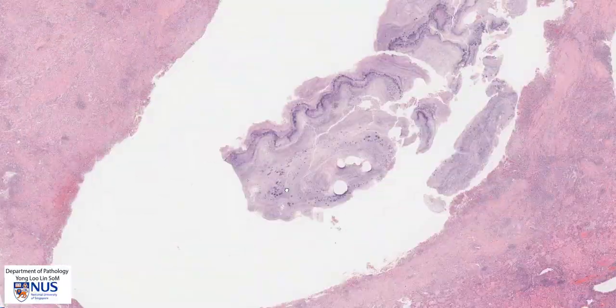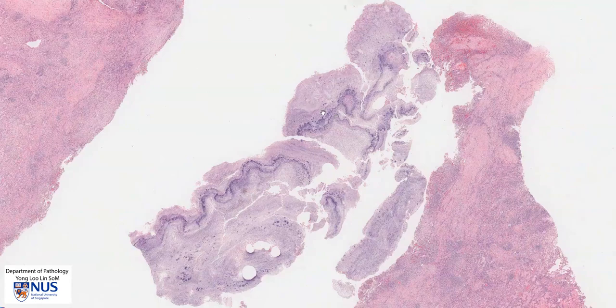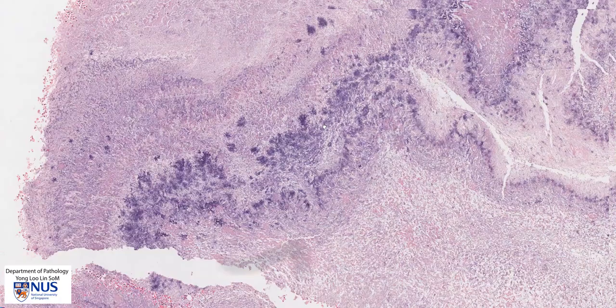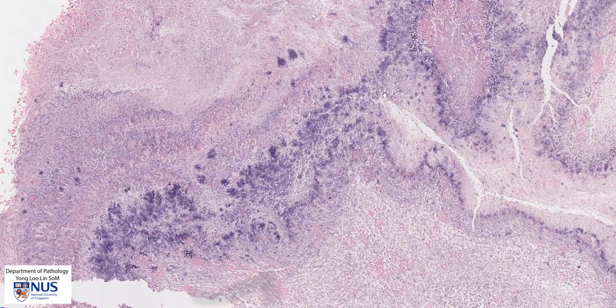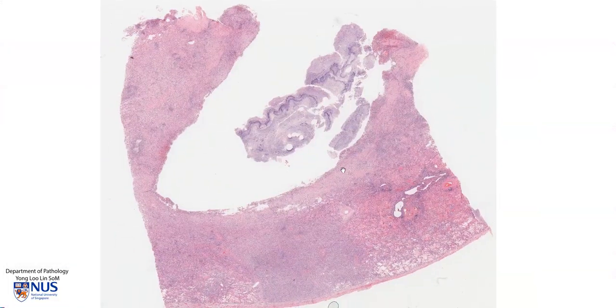Moving back to the area of the abscess, we see that it's mostly an empty cavity where the contents have fallen out. But zooming in, we can actually see that there are lots and lots of bacterial organisms forming clumps within the abscess itself. It really depends on the timeline or the age of the abscess. Sometimes abscesses that have been around for a while may actually have a rim of fibroblasts or fibrous tissue around them.